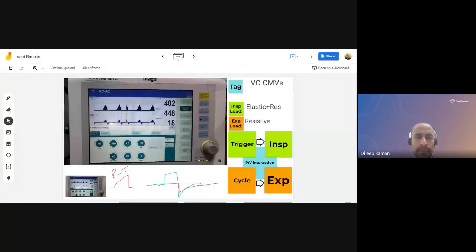Yeah, I wanted to discuss that screen only. Once you will show the screen, I had some queries. Yes, that's why I'm pulling it up. This one, right? Yeah. So go ahead, ask your questions.